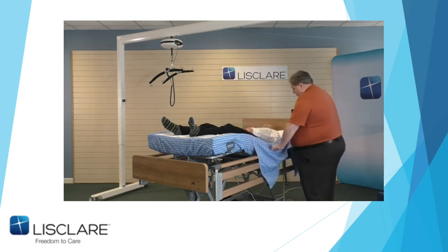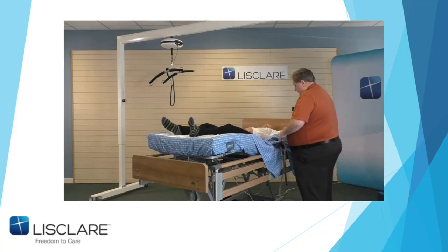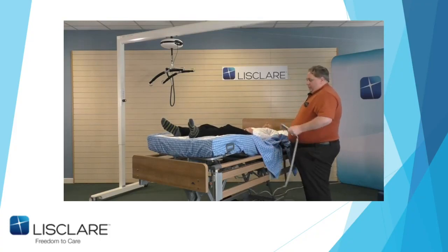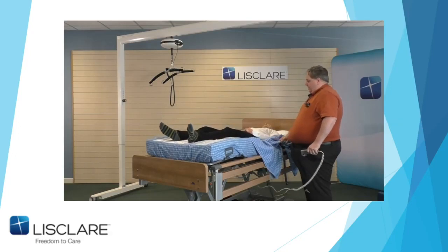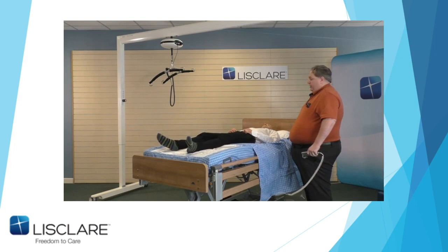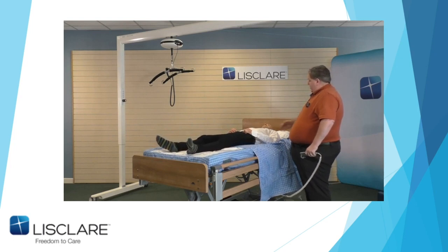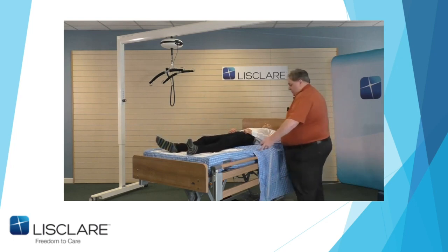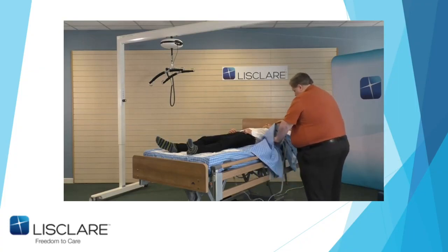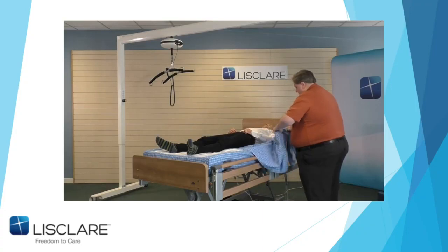Now, this is one thing I want to put the bed down flat so you can see this, okay? There's a technique here that takes a bit of practice. And you'll see this more when I'm turning on the bed and things like that. But because I've pulled John back diagonally, what I want to do now is get him square on the bed, okay? So he's up the middle. So hang that back up again.